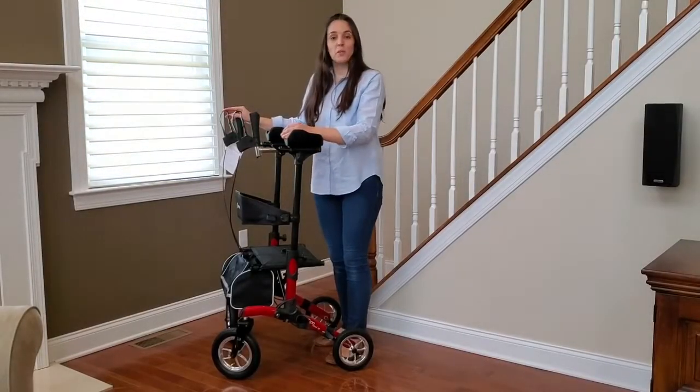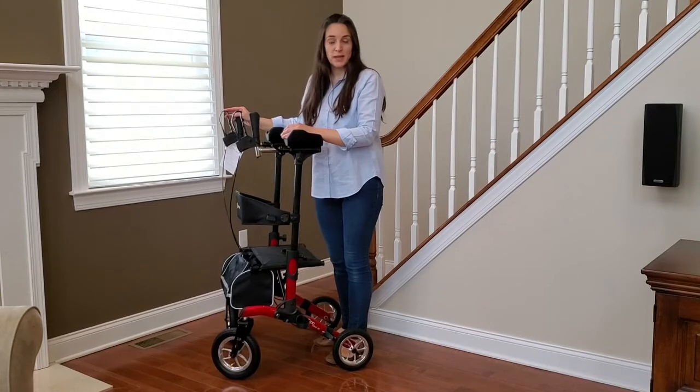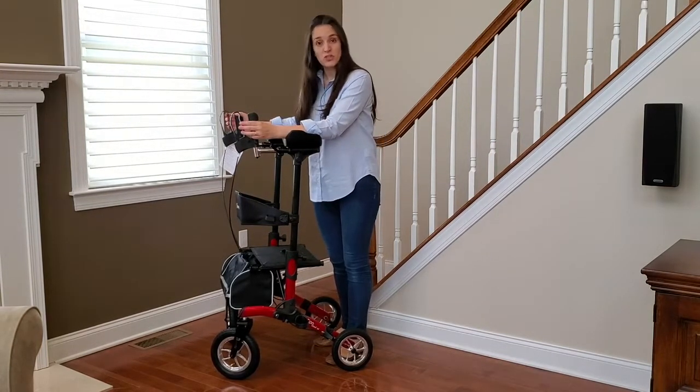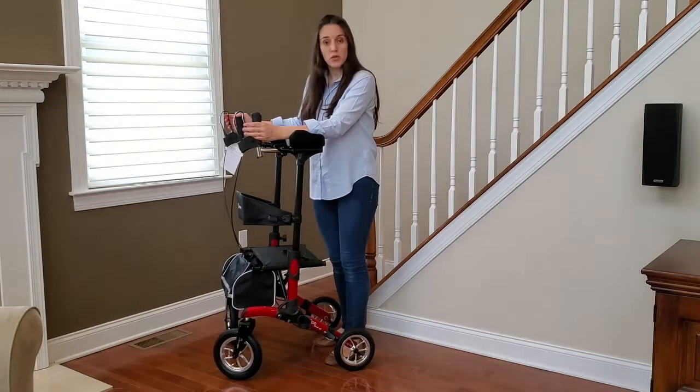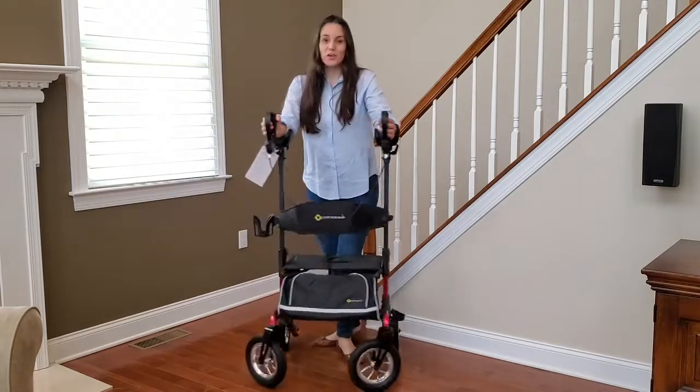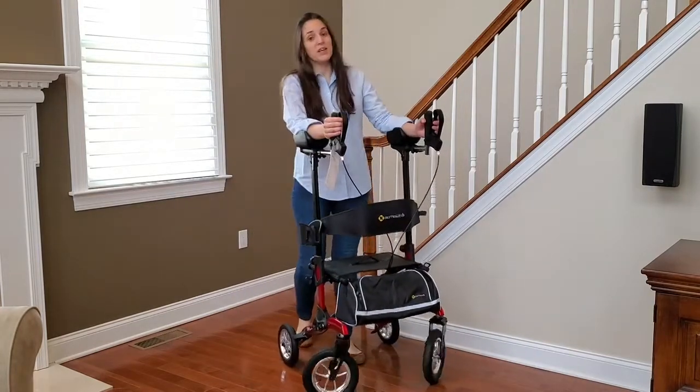Now that your Comadita Tipo Stand Up is assembled, it's ready to use. But first, make sure that your brakes are adjusted — if they are not, watch our video on how to adjust the brakes and you're ready to go. You can walk straight comfortably. Enjoy!